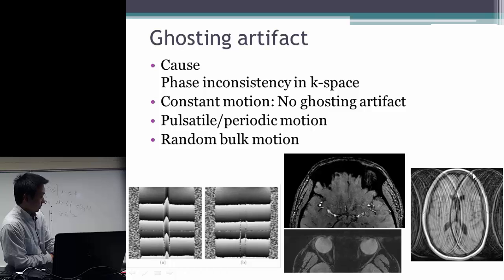And because we can also see different spatial frequencies. For example, here is a lower spatial frequency, while in here, these ones have a much higher repetition of the ghosting artifact. That means you probably moved during the acquisition of the K-space center, so that it created this low spatial frequency artifact. Or you also moved when it was collecting the edge of the K-space, so that you can see those high spatial frequency components.